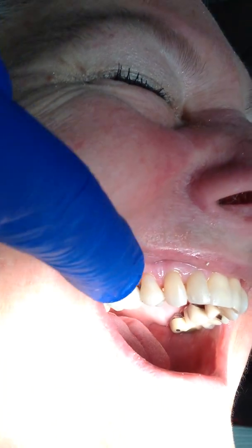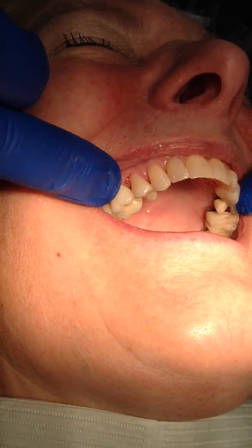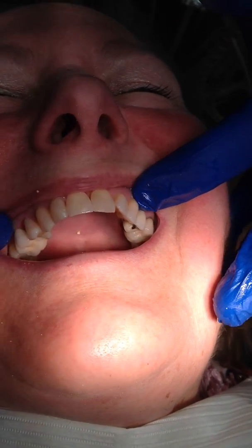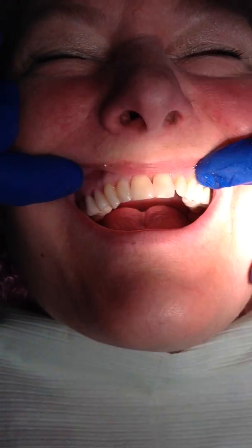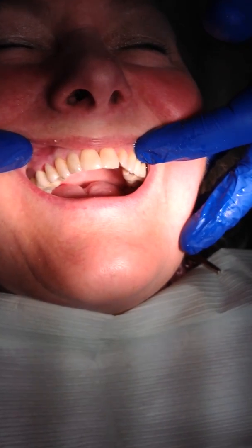I realize that putting the band on takes time and effort, but you more than save that in finishing and in actual result. When you look straight on to the tooth, you see how nice that tooth looks at the gingival aspect of it. Very nice.